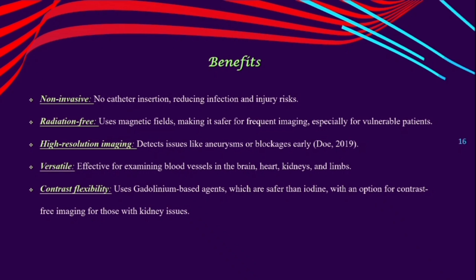Versatile. Effective for examining blood vessels in the brain, heart, kidneys, and limbs. Contrast flexibility. Uses gadolinium-based agents which are safer than iodine, with an option for contrast-free imaging for those with kidney issues.